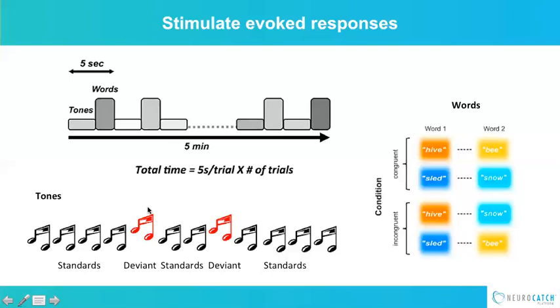That's the oddball, right? And from an evolutionary standpoint, this should be fairly intuitive in the sense that you could be walking in the forest and all the sounds are standard and you expect them. And then if a stick snaps, it sort of is a deviant sound that you would pay attention to. And that's exactly what the neurocatch does.